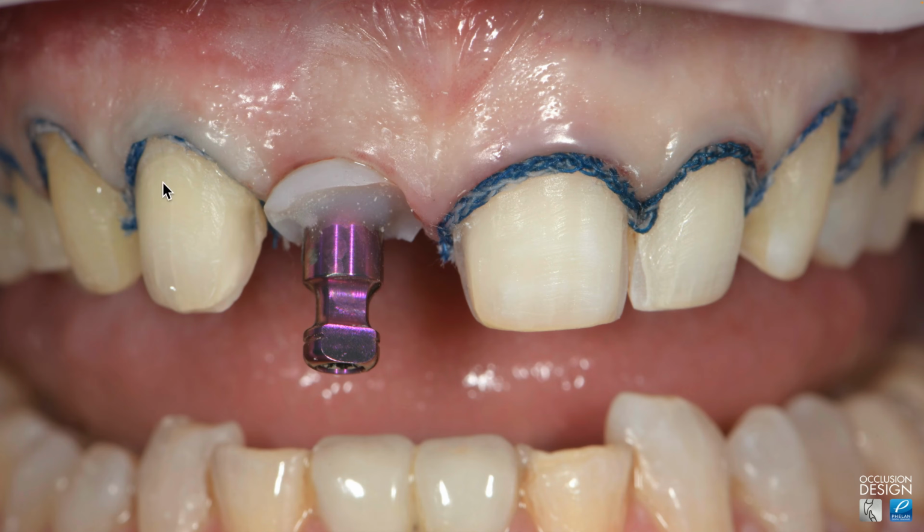You can see here, all of this is enamel, all of this is enamel. There's some dentin here because of the way the shape had to be. And there's some dentin exposed here, but all of this is enamel. All of this is entirely enamel. We have a lot of enamel to bond to for the preps.